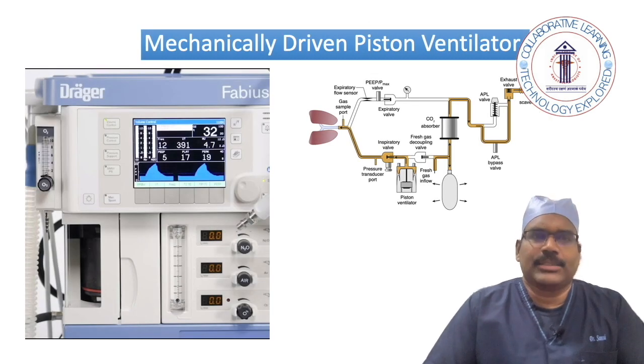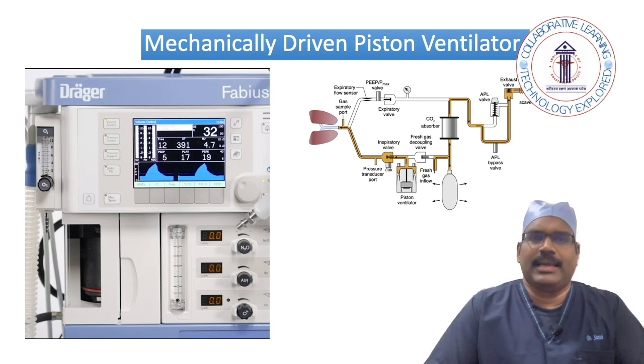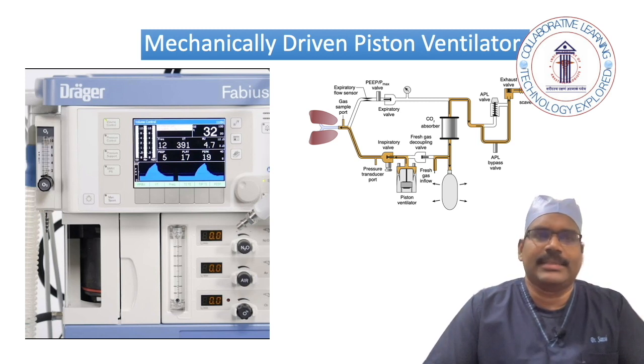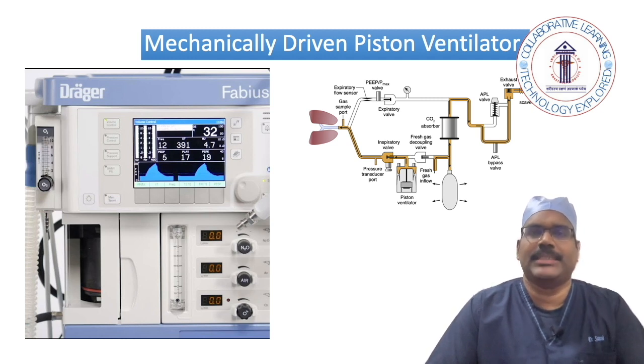Mechanically driven, electronically controlled piston type ventilators use a computer controlled stepper motor instead of compressed drive gas to deliver the tidal volume. These are single circuit ventilators because there is not a separate ventilator driving gas circuit. The piston operates much like the plunger of a syringe in a cylinder of essentially zero compliance. The ventilator has primary control over the volume displaced in the circuit and uses the data from the pressure sensors to create pressure controlled breaths.